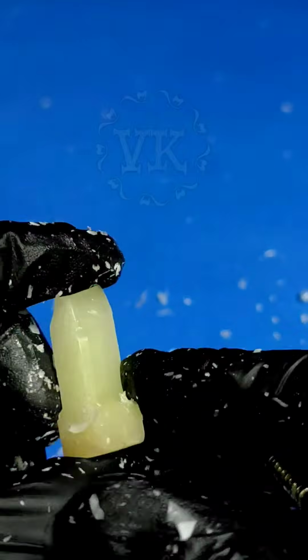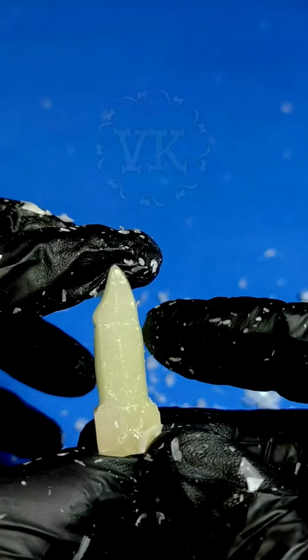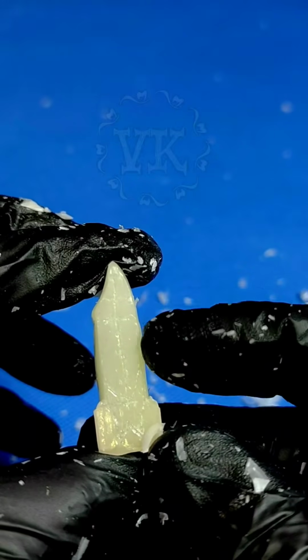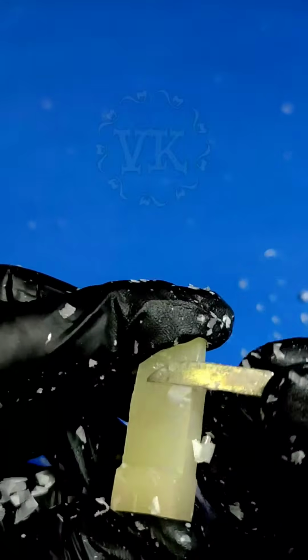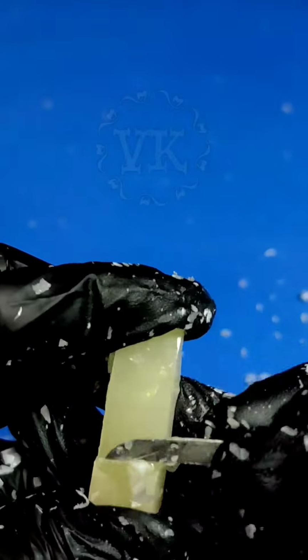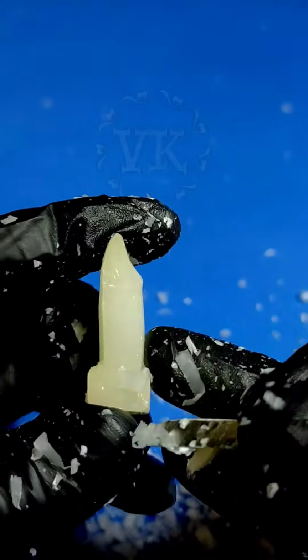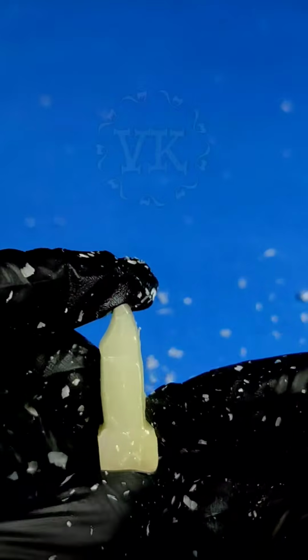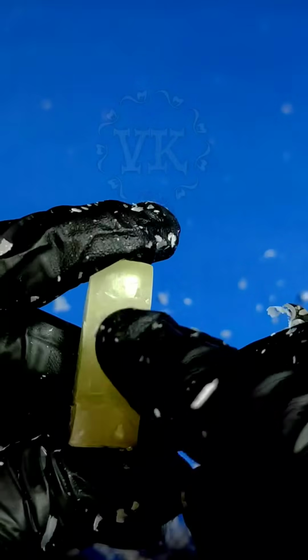So that's what we're trying to do. We removed the wax. There is still a little bit more projection here. I want to remove this portion also. So here there is still some bulge from these portions.